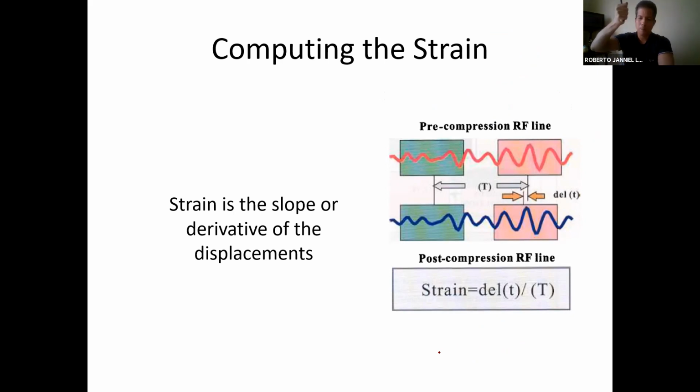Because if you apply too much force, you know what happens, because we're talking about almost fluid-like, but really solid media. If you compress it, like we saw in previous slides, it's not only that you're going to apply a perfect elastic compression or expansion, but you're going to have a bulk deformation and move things to the side. That's going to give you decorrelation, which is the same problem you have in Doppler.